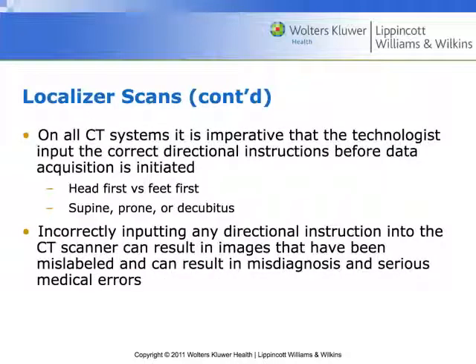And then as we are starting to initiate these localizer scans, we're going to make sure that the way the patient is oriented on the table is correctly inputted into the machine. Most protocols already have a patient orientation that's preset in the CT control console. So when I initiate, for example, a CT chest, it knows that the patient is head first and supine on the scan table, right? If for whatever reason I needed to, like say the patient came from ICU and I needed to flip that around so that they're going feet first in supine, I will need to flip.